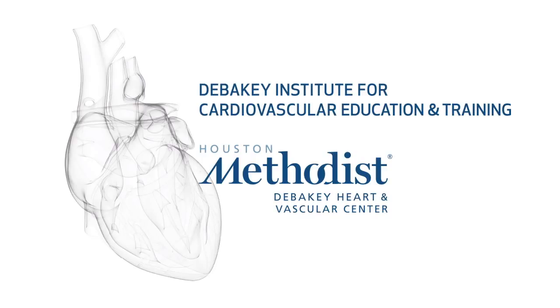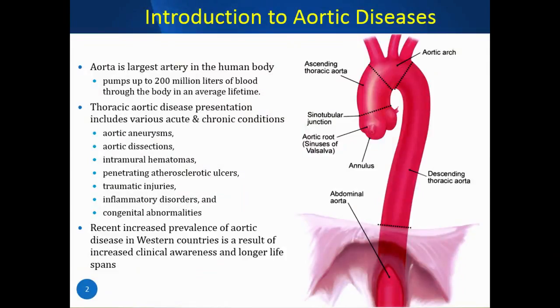Thank you for coming. We're going to be talking about aortic diseases today. I will be the lead-off hitter, followed by Dr. Quinones. I'll be covering CT and CMR, and Dr. Q will be covering echo, and then a general summary of how we can evaluate patients with aortic disease. Now, I think both Dr. Q and I can attest this is a very large subject. We have done our best to make it compact for y'all, but there are a lot of different disease entities that involve the aorta.